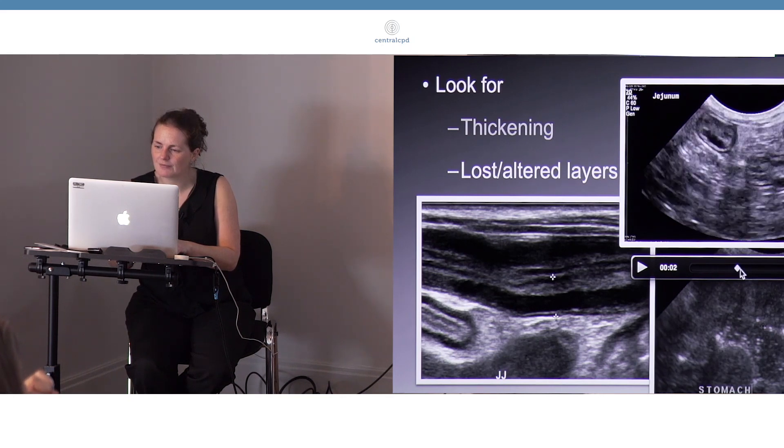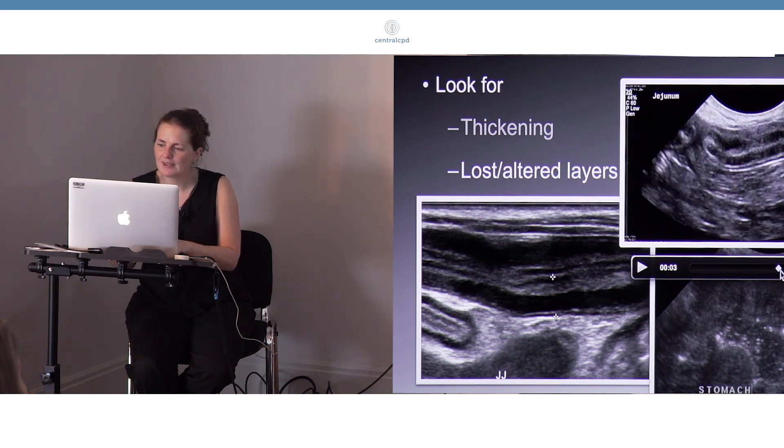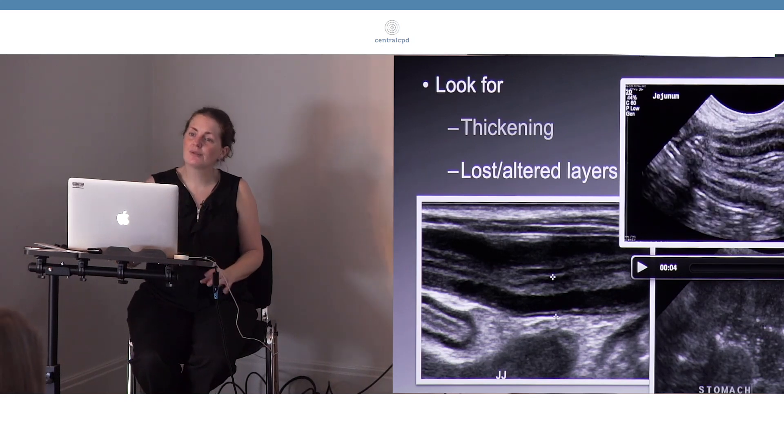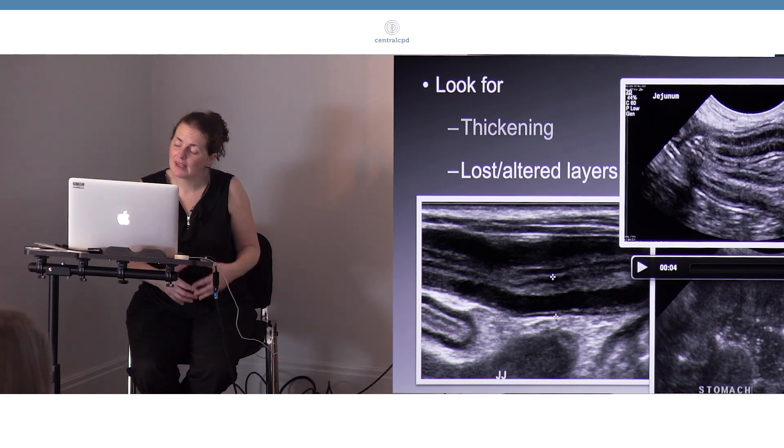As if they're making some striations which are perpendicular to the long axis of the bowel. And we see that, I think, sometimes best when we see it as a little clip. If you look, those little dots that are present, they're just starting to align in one way.